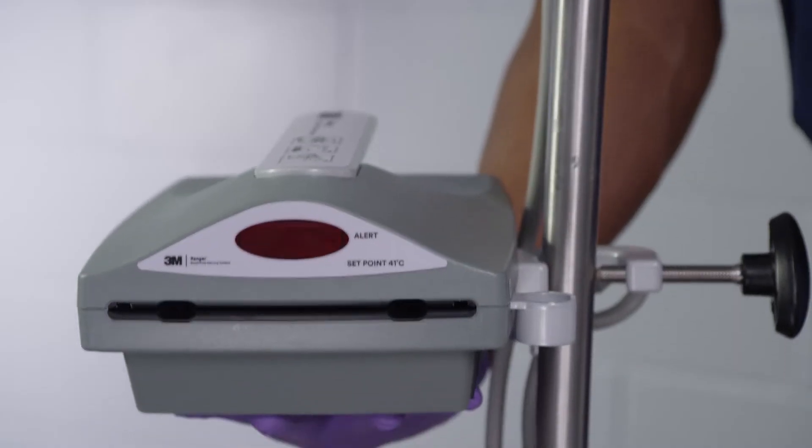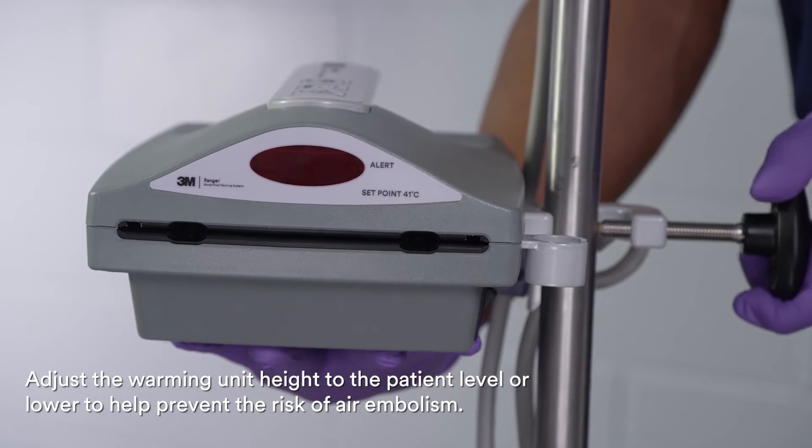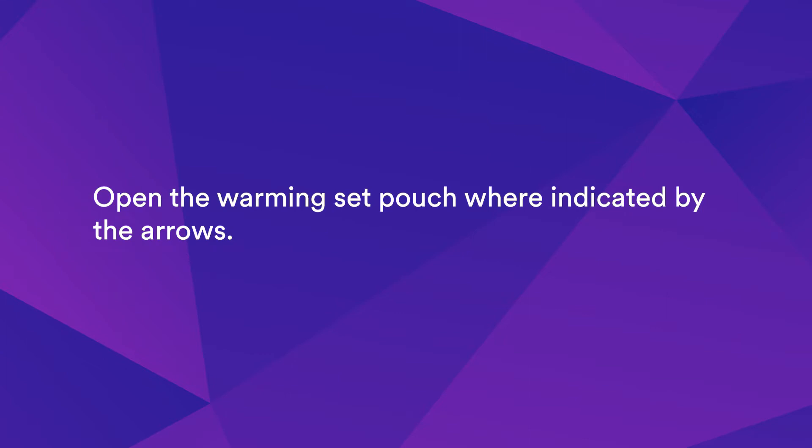To begin use of the Blood Fluid Warming Unit, adjust the warming unit height to the patient level or lower to help prevent the risk of air embolism. After securely mounting the warming unit, plug the power cord into a grounded outlet. Open the warming set pouch where indicated by the arrows.